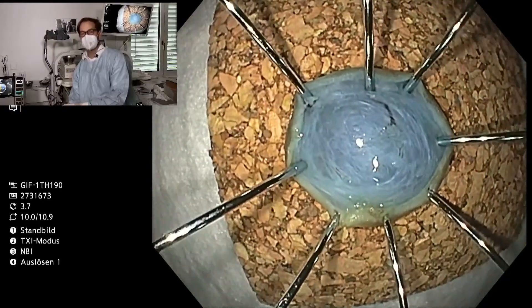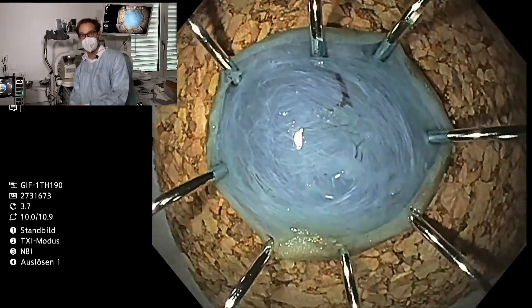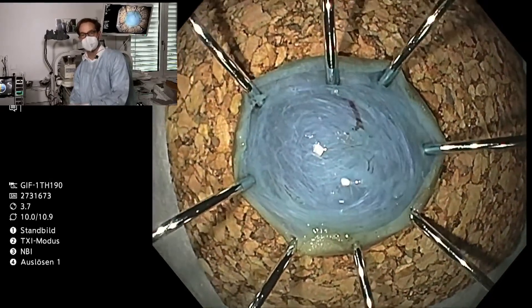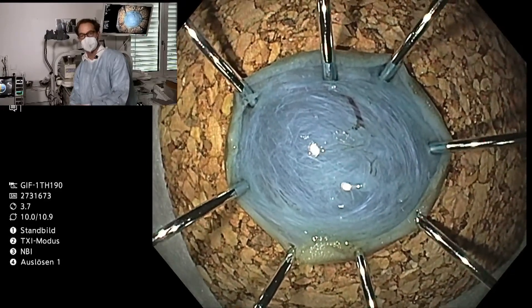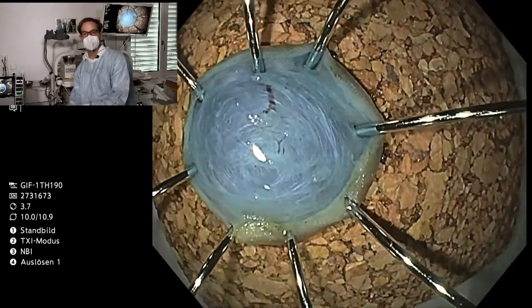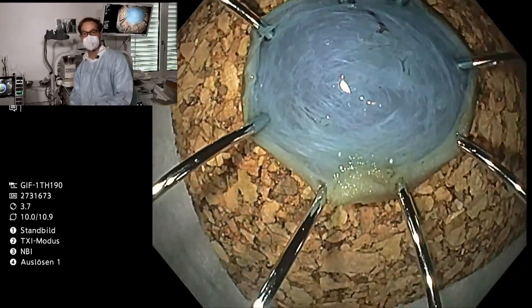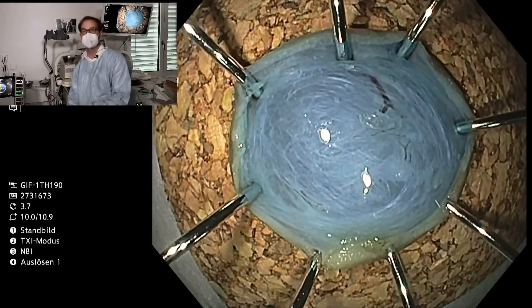You can see the resected specimen, and going a bit closer, the lesion is completely covered by a bluish submucosal layer. So I think it is resected completely. Of course we will ask our pathologist whether it is completely resected, and what kind of lesion it is — whether it is a NET tumour.